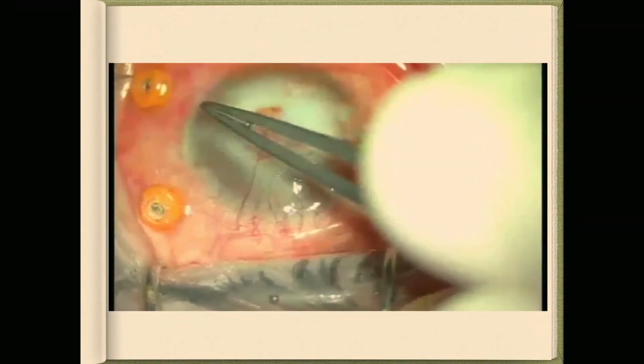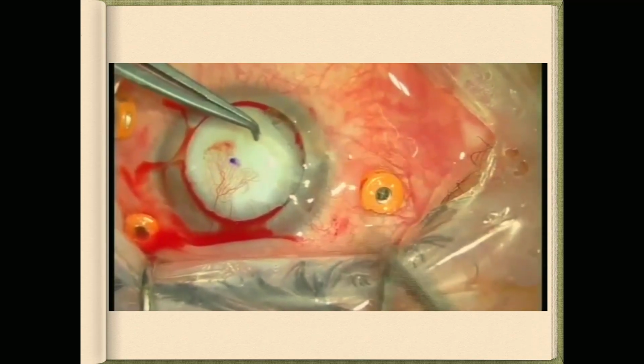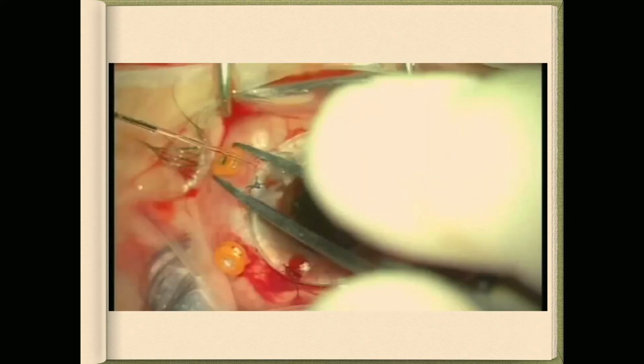The best way to deal with this issue is using the temporary keratoprosthesis. We use the suction trephine, as we are watching in the video, removing this diseased button and putting in the temporary K-Pro, the temporary keratoprosthesis. Doing vitrectomy, as we see here, the K-Pro gives us a very neat visualization. I can also use a bimanual technique like this to cut the subretinal band, the submacular band.